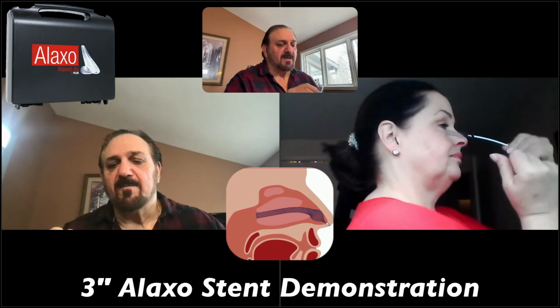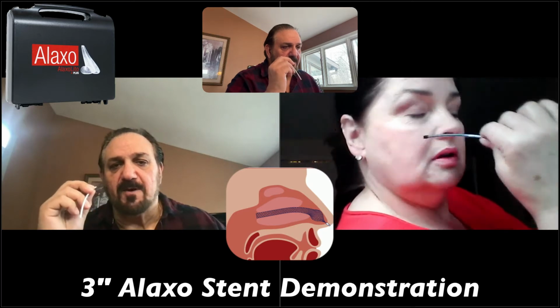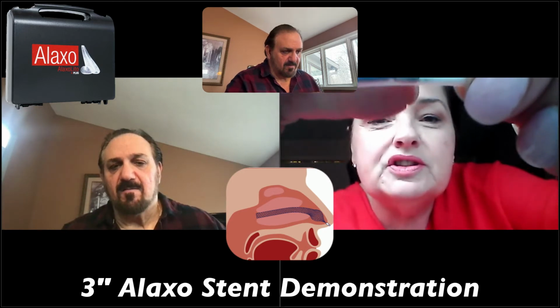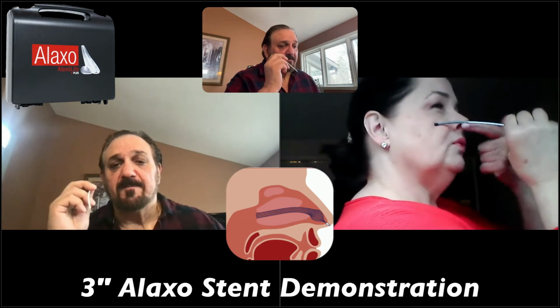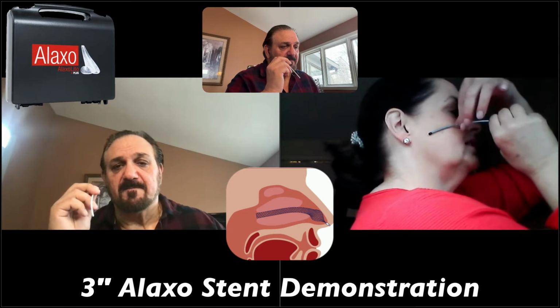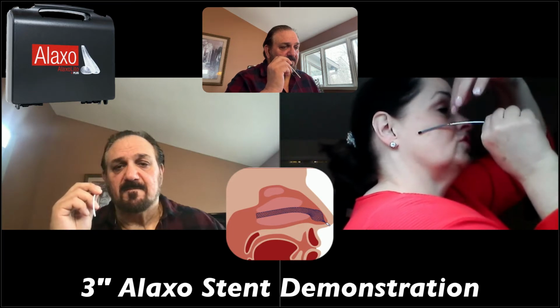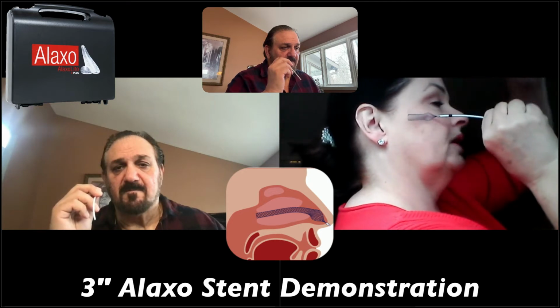I'm sorry, that last part, the insertion tube lets you, what does that mean? How far do you put it in? If you look in the insertion tube, you'll see the silver ball. That's your guide. You want that silver ball to basically be at your nostril. You're going on a slight angle downwards towards your lower earlobe, and once you can feel the metal thing is there, you don't want it right at the end of the insertion tube, because that's a little too far. Then we pull this back to expand it and take it all the way off. That's when it expands against your turbinates.